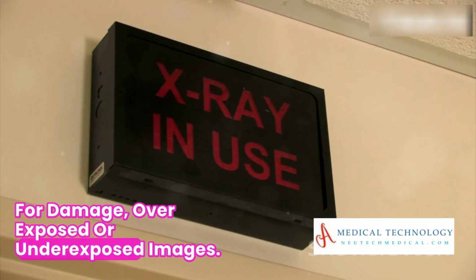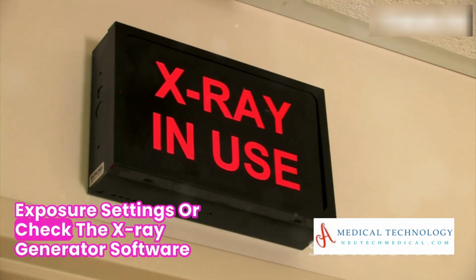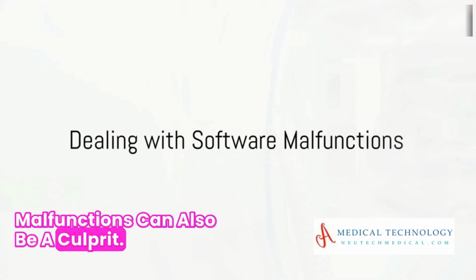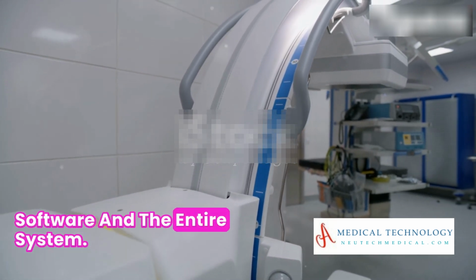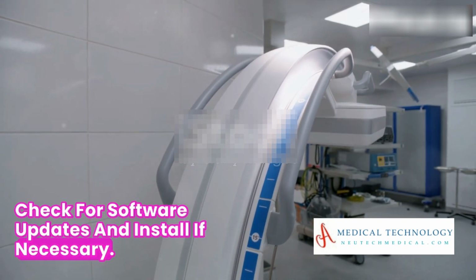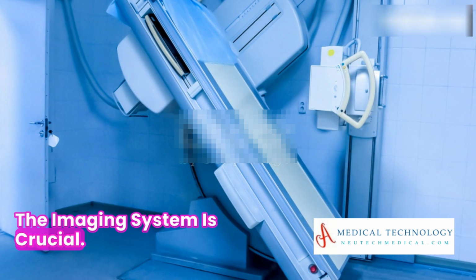Overexposed or underexposed images? This could be a signal to adjust your exposure settings or check the X-ray generator. Software malfunctions can also be a culprit. In these situations, restart the software and the entire system. Check for software updates and install if necessary. And remember, proper calibration of the imaging system is crucial.